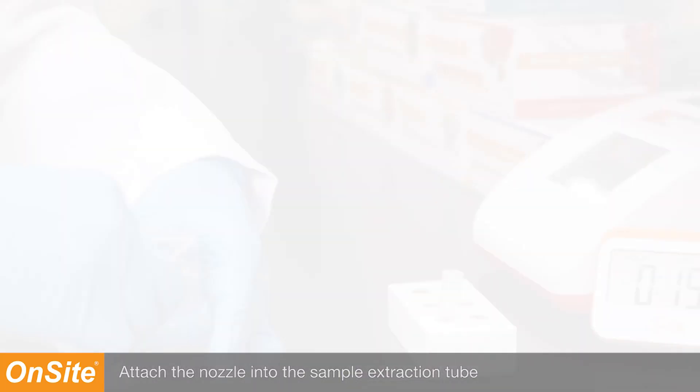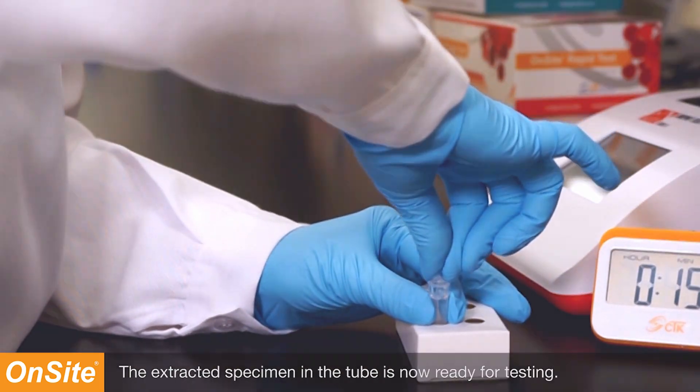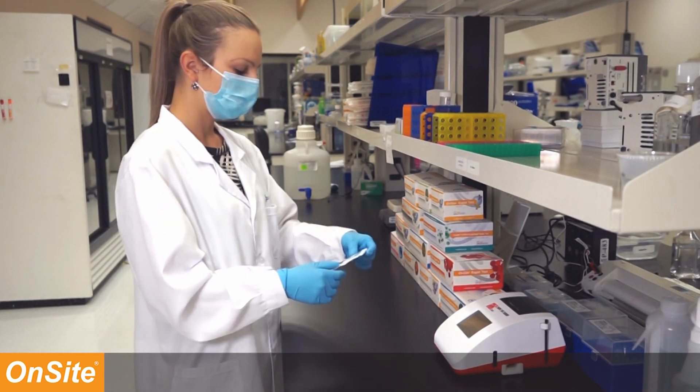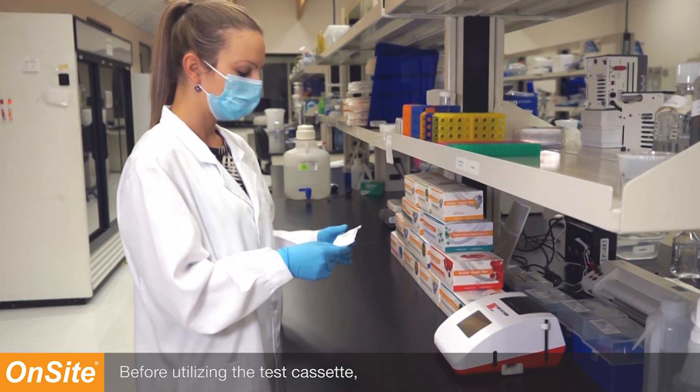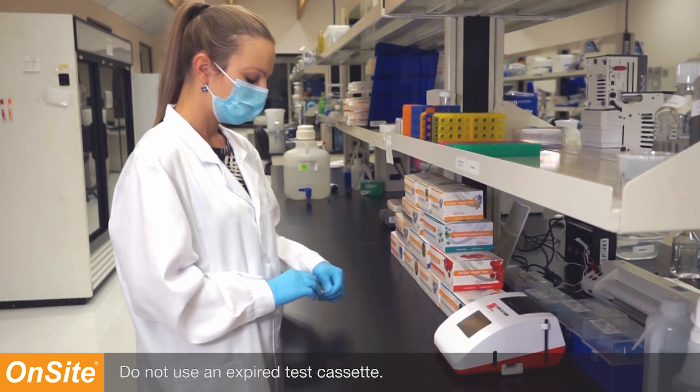Attach the nozzle into the sample extraction tube containing the extracted sample. The extracted specimen in the tube is now ready for testing. Before utilizing the test cassette, make sure to check the expiration date. Do not use an expired test cassette.